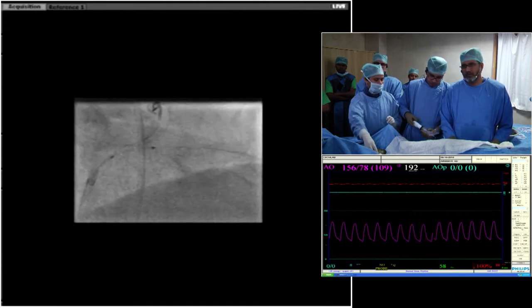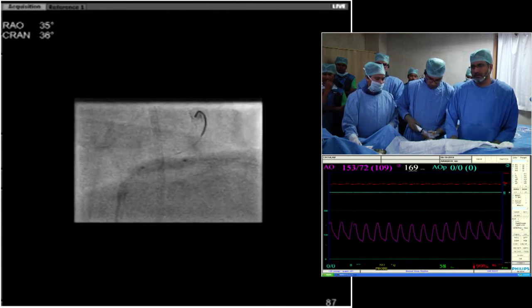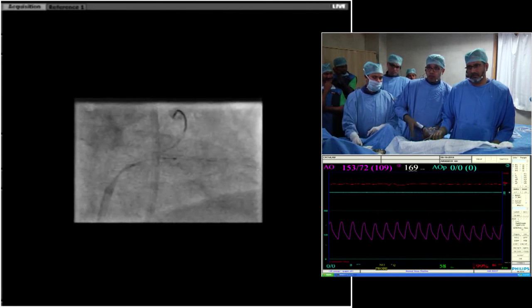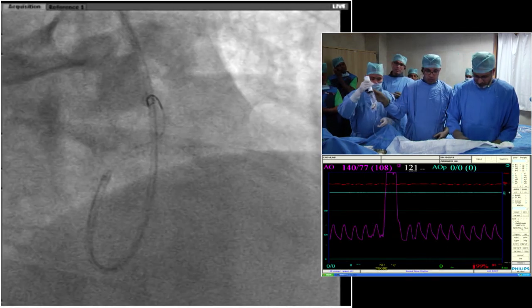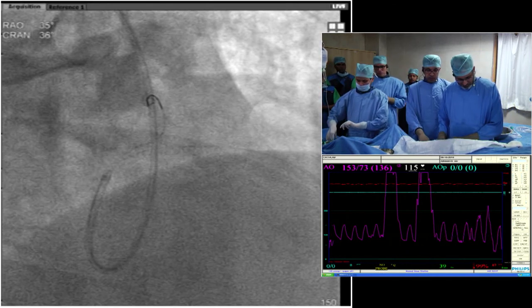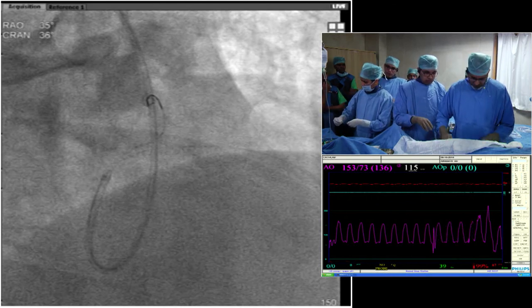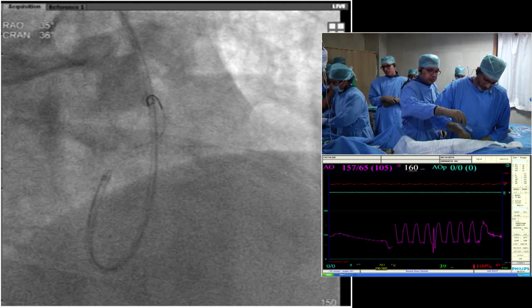I didn't do a calculation of the SYNTAX score, but it looks like a moderate, intermediate kind of score to me, somewhere in the 20s, I would imagine. So do you have a heart team approach, discuss all these patients with your cardiac surgeons and so forth? By the way, did you calculate a SYNTAX score on this gentleman? Yeah, you're absolutely right. I think your guess is right. We calculated the SYNTAX score. It came up to 21. We do have a heart team approach where we have a surgeon, and we do discuss often the best treatment strategy, taking into account patient preferences.